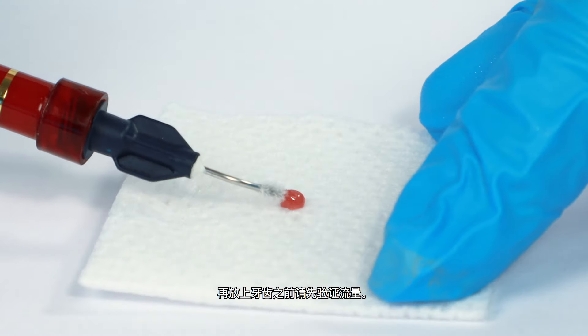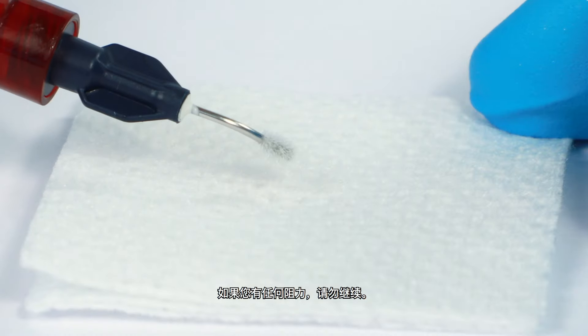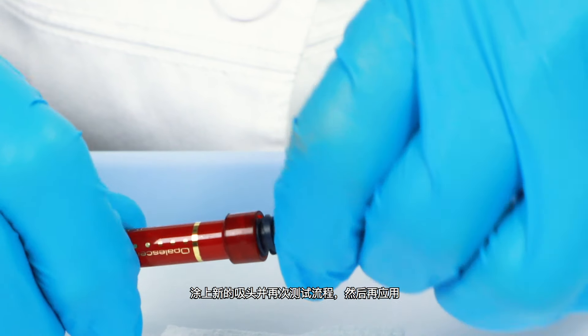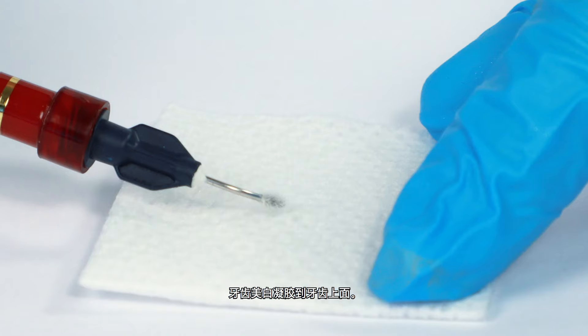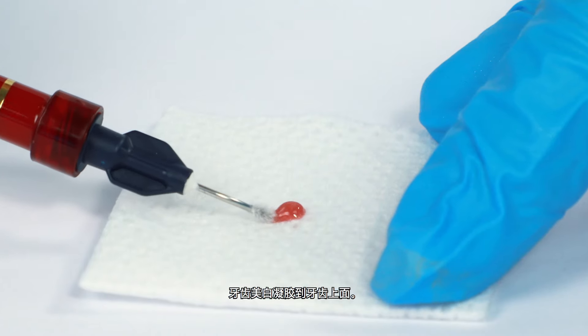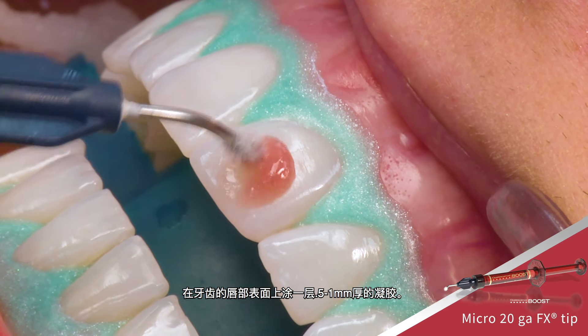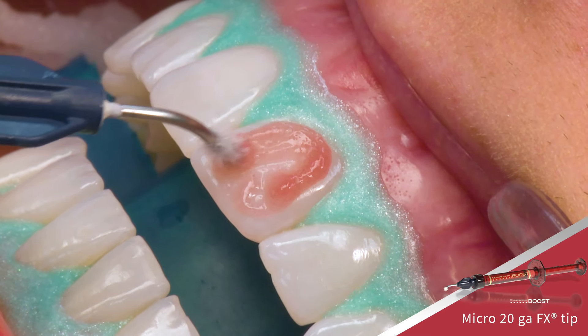Verify flow prior to applying intraorally. If you feel any resistance, do not proceed. Attach a new tip and test the flow again before applying Opalescence Boost whitening gel to the teeth. Apply a 0.5 to 1 millimeter thick layer of gel over the labial surface of the teeth.